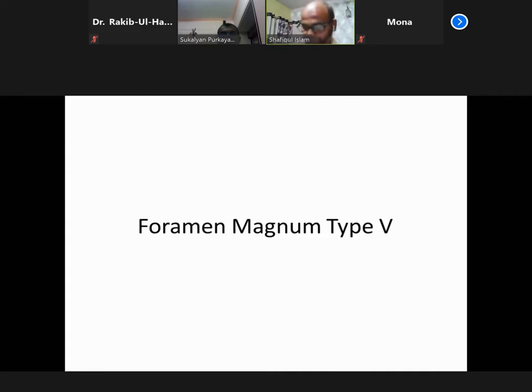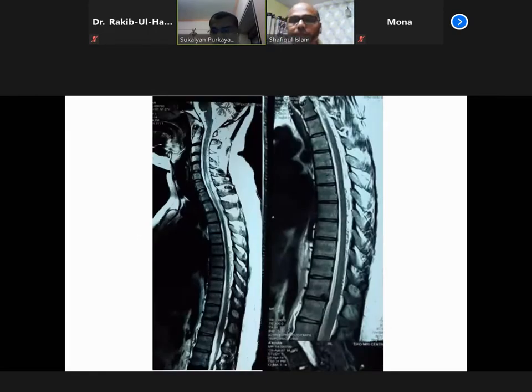Thank you. Okay, so foramen magnum. It is an area which is again a bit difficult to treat, and usually we see a very high-grade fistula here, like a type 4, type 5 fistula, or type 3B sort of fistula. Now, this is a young guy, a very jolly young guy. He came with bilateral lower limb weakness. If you can see this, there is a bit of hyperintensity in the cord in the cervicodorsal region, and there are a lot of tiny flow voids going quite far down.